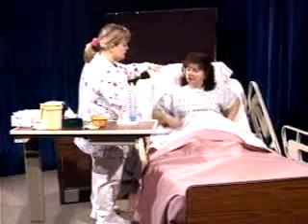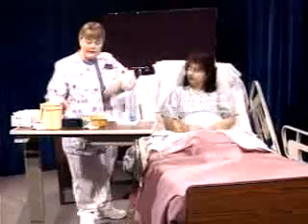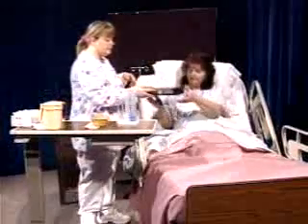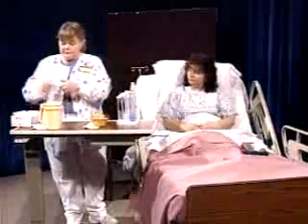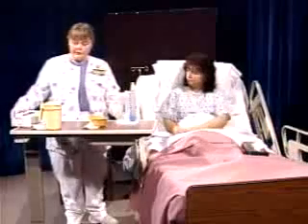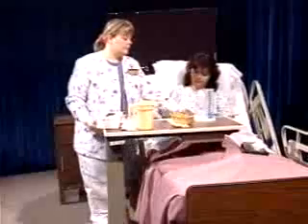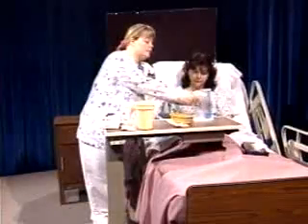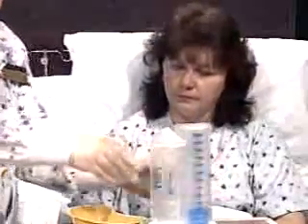Elevate the head of the bed and assist the patient to a comfortable sitting position. Explain the purpose for doing the exercises and review the procedure with the patient. Put on your gloves. Set the device, called a spirometer, to the predetermined volume.